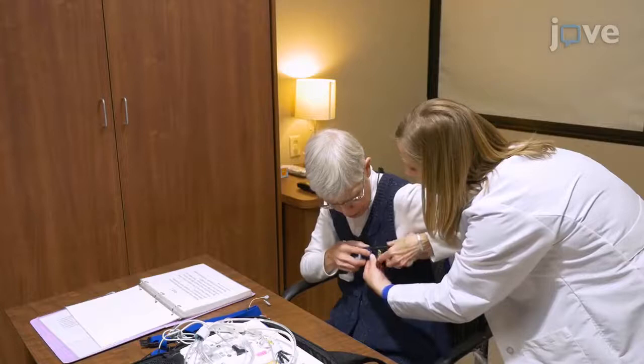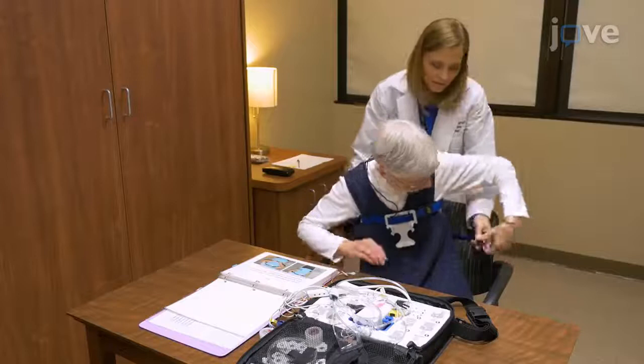Then place the other blue belt around the waist and tighten the belt until it is snug enough so it does not slide when moving during the night. Point the arrow on the belt buckle facing down.